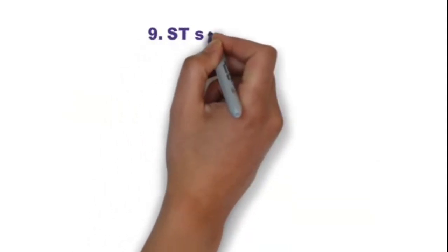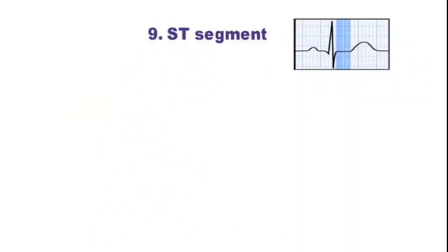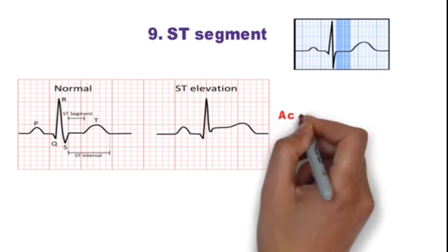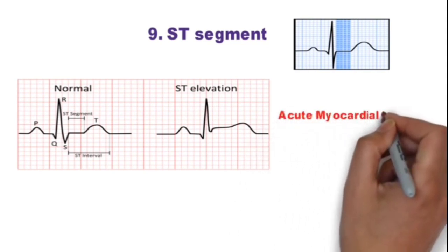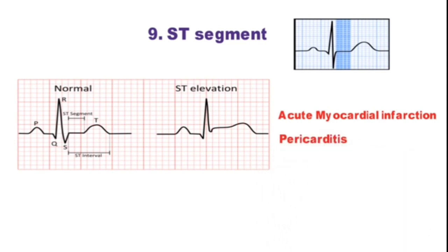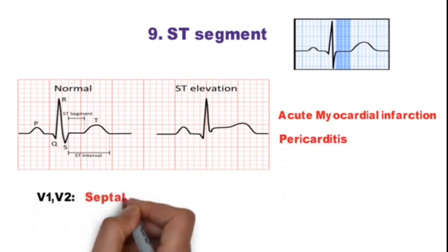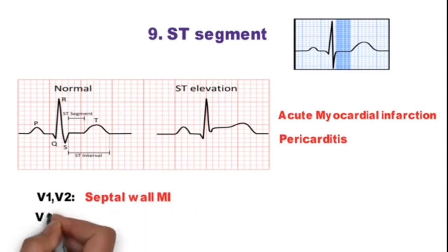Step 9 is ST segment - the flat isoelectric section of ECG between the end of S wave and the beginning of T wave. In this ECG, you can see ST elevation, which could be due to acute myocardial infarction or pericarditis. ST elevation in V1-V2 indicates septal wall MI.